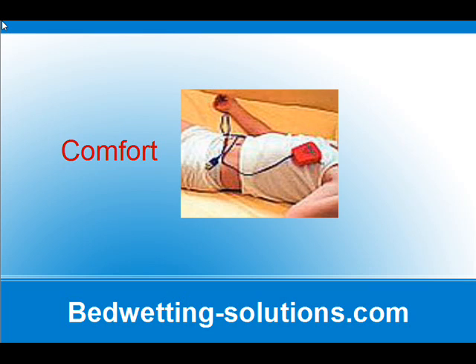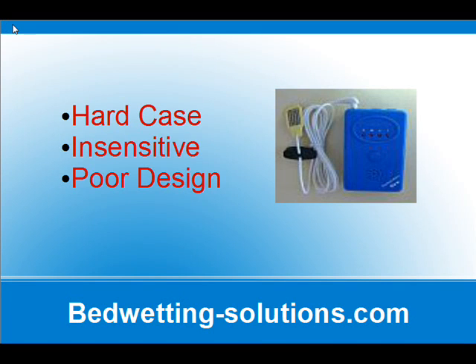This design is cheap. It's all over eBay. It has a big hard plastic box that clips to the shirt and a little gizmo that you stuff in the child's pants. It also has lots of lights to amuse and confuse you, and it has several sounds. None of that is good.